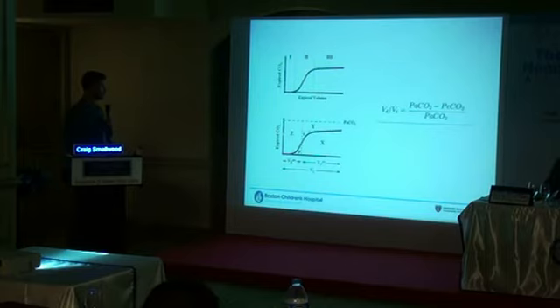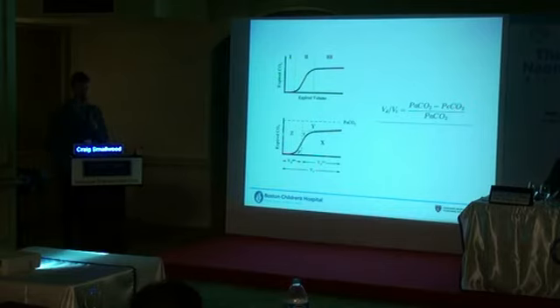VD to VT. This is the Bohr modification of the Enghoff modification of the Bohr equation. And basically, VD to VT, so volume of dead space to tidal volume, is basically a fraction. We take the partial pressure of CO2 in the arterial blood minus the average value during the exhaled breath over PaCO2, and that calculation yields our VD to VT fraction.